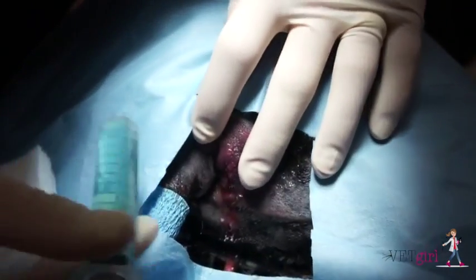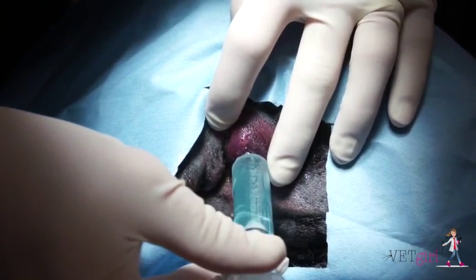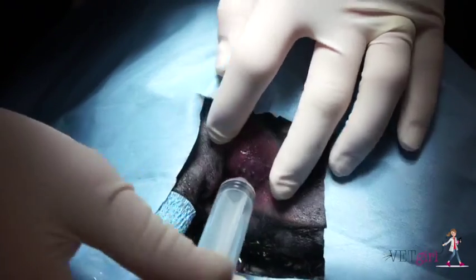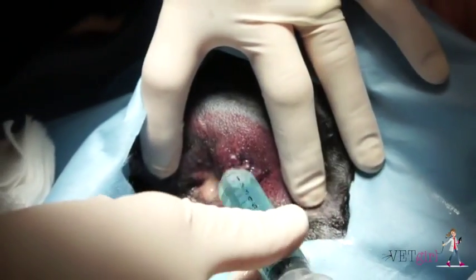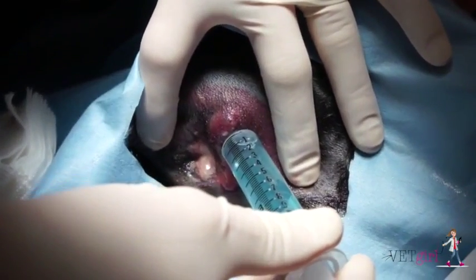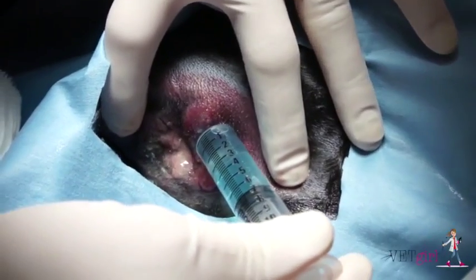Next, using a dilute chlorhexidine solution, we're going to flush out the anal gland. Make sure to press the syringe against the skin to help form a seal, then flush copiously with pressure to help dislodge any purulent material from the anal gland duct.